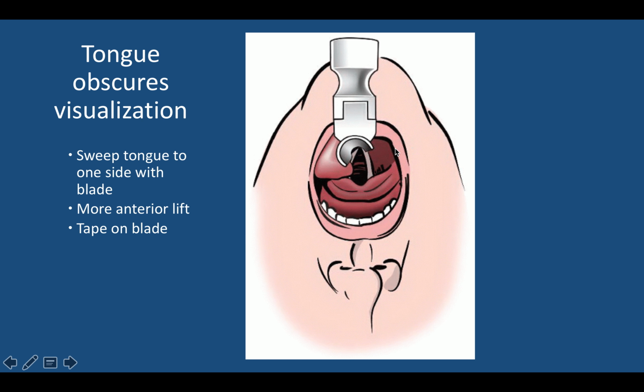I'd also like to highlight here the area of the blade that we were discussing that looks like a small tube. You are not sticking your endotracheal tube down this area. You would be coming in through the side of the mouth. This area is to make sure that you can see the vocal cords as your tube comes in from the side of the mouth.